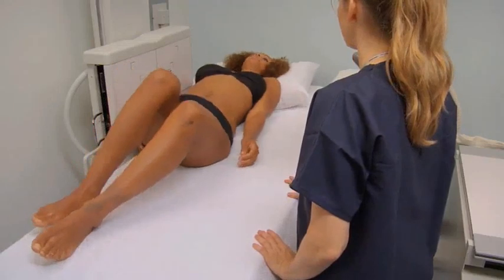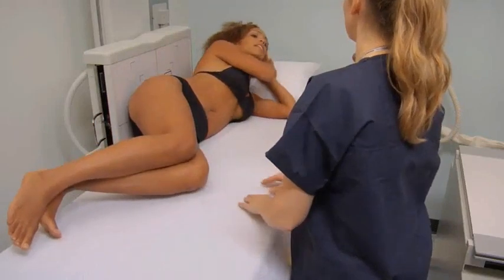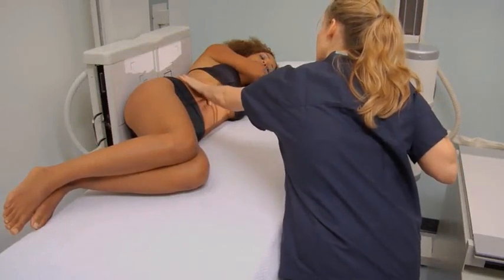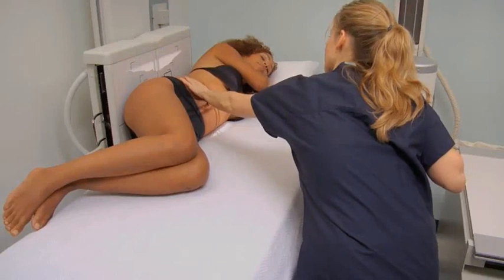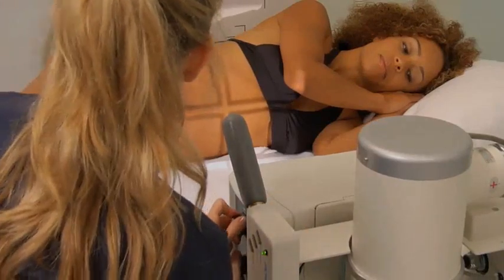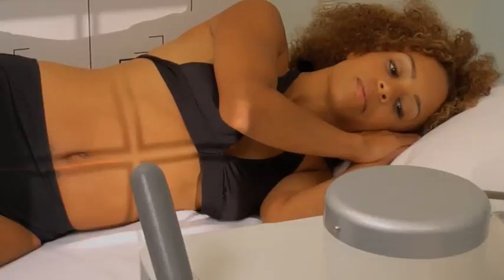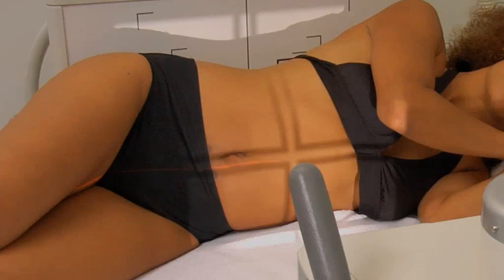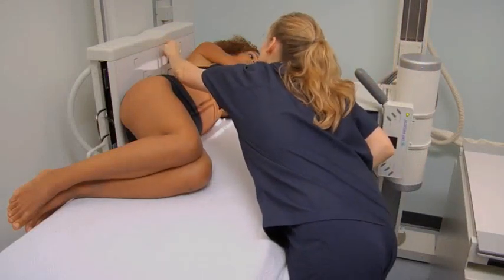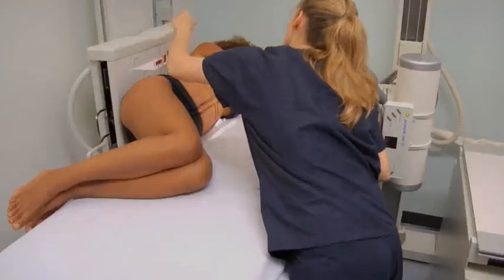Position the patient on a bed or stretcher in front of the upright bucky. Ask the patient to lie on their side with their back against the image receptor, with arms and knees flexed and hands under their head. Check for rotation by palpating the shoulders and anterior superior iliac spines. Align the central ray with the midline of the abdomen, approximately 2 inches above the iliac crests. Center the image receptor to the central ray. Collimate the light field on all four sides to include the diaphragm, lower ribs, lower abdomen, and lateral soft tissue borders of the abdomen. Place the appropriate lead markers for the patient's uppermost side and the decubitus marker on the superior aspect of the image receptor within the light field.